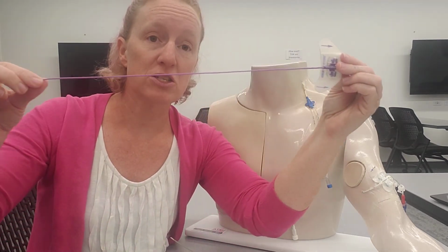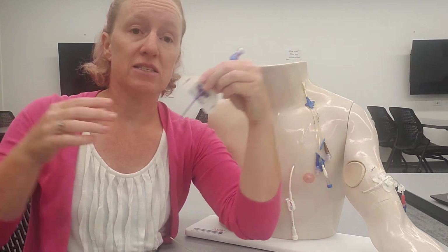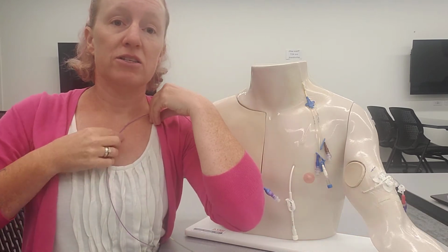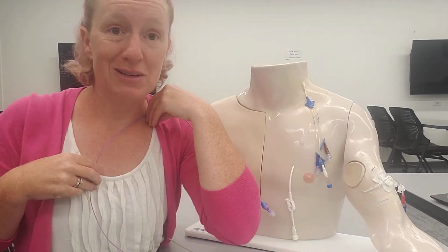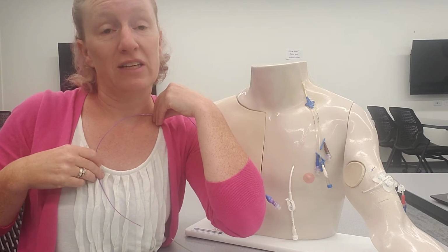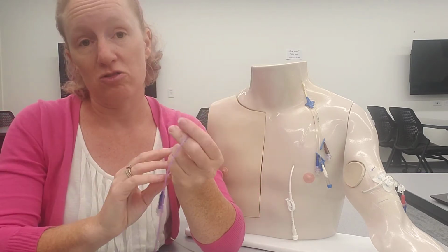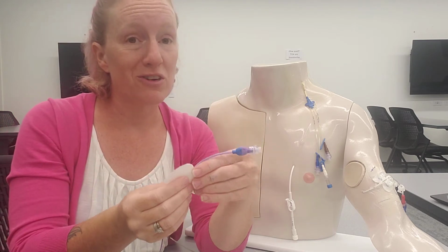You can see by this tubing that it's nice and long. This is going to be inserted out on the peripheral space here, and then it's going to go up all the way into the center. So where's that tip? That tip is in the superior vena cava, just before the heart. It's in the center of the body, making it a central line. So that's really important for us to understand. The scope changes between central lines and peripherals.